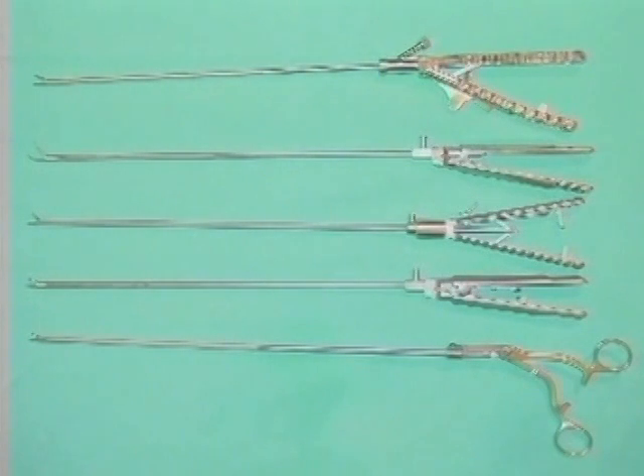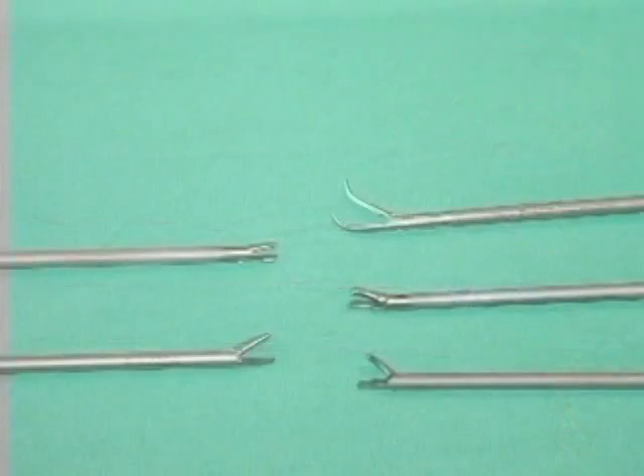Several laparoscopic needle drivers are available, which you use as a matter of personal preference. As in open surgery, the use of instruments not specifically designed for laparoscopic suturing is not recommended.